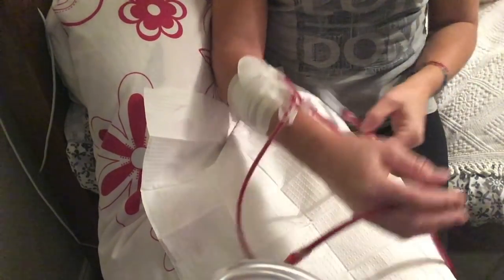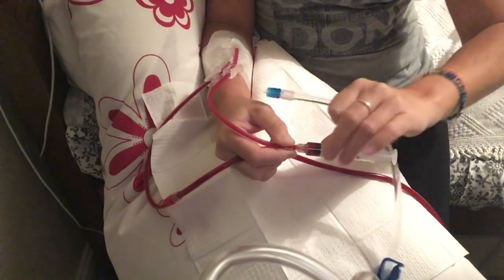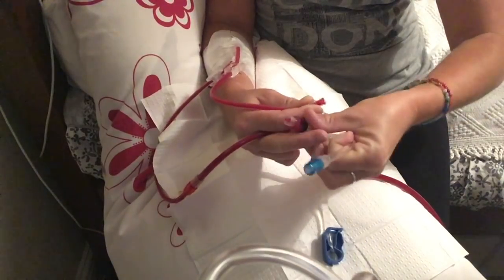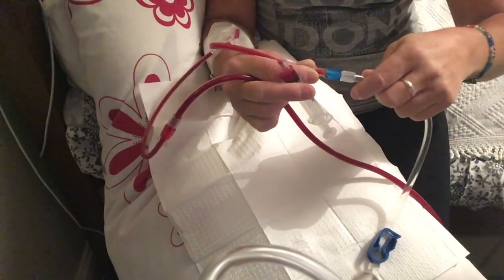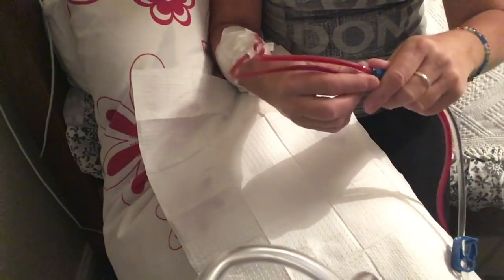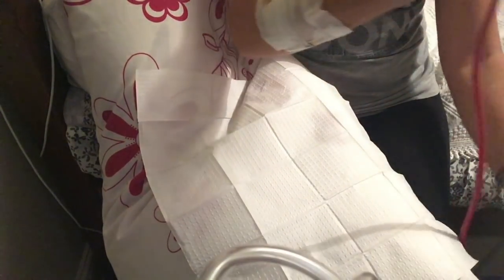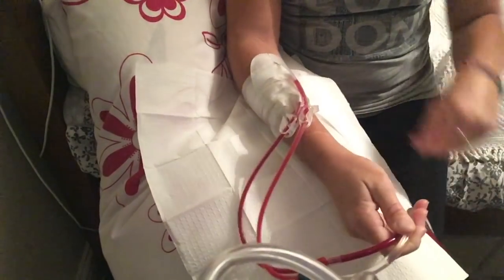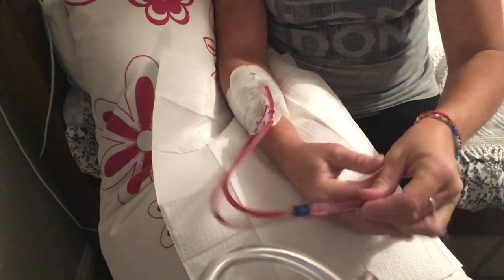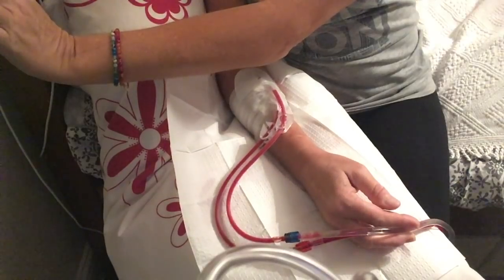I've clamped that, and I'll just get that line — this is the venous needle. I always make sure they're really well connected, and I tape over the connections as well once I'm up and running. The venous line is now open. I turn the blood flow right back down to slow to start with, just until I know that it's flowing okay.